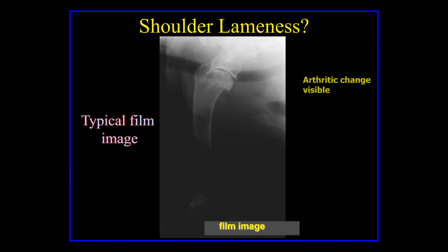The other advantage to most digital X-rays, and I say most and I'll tell you why in a minute, is that the image quality is so much better than it is for analog films. The really cool thing is that when you were shooting analog films with film screen, you had to measure the thickness of the dog, say he's 12 centimeters thick, and look up on a chart, and adjust the kVp and the mAs for a 12 centimeter body part, and then hope that you would get a nice film.